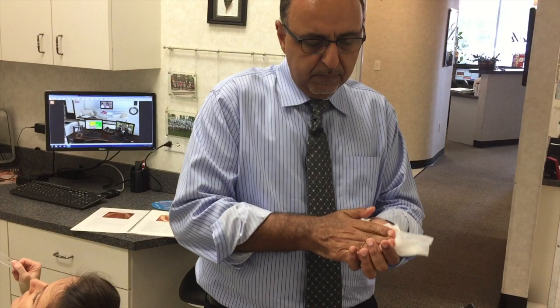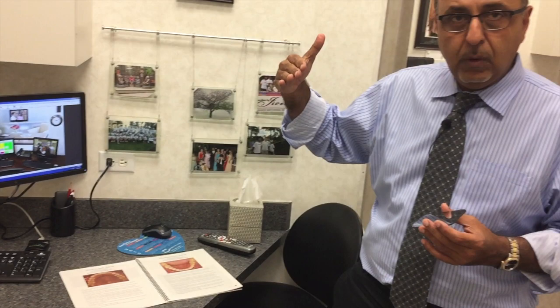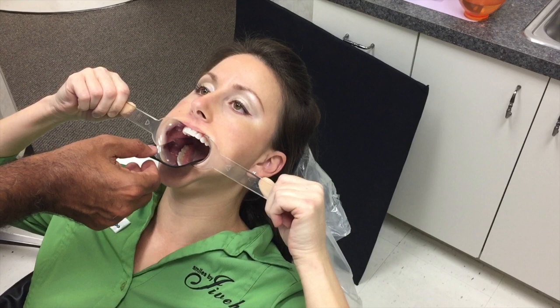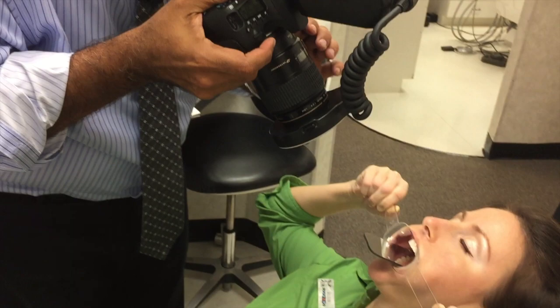Take it away and wipe it. It's very important not to scratch these mirrors because you want to keep them for a long time. Ask the patient to retract the lips. If you look at the photo, you want to see the facials of teeth #8 and #9 — if you're getting the facials of the incisors, that's a good shot. Fit that back in. Aileen happens to have veneers that we are going to replace. Turn this way — now I can definitely see the facials of the front teeth. If you're not getting the molars, just tilt the mirror a little bit and come in and out to take the shot.